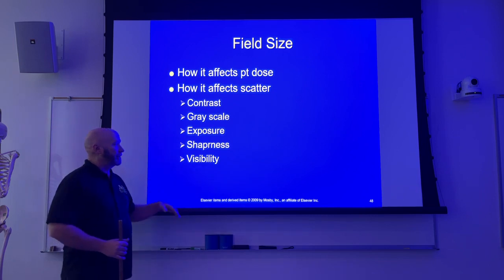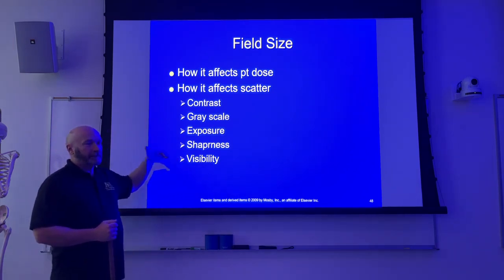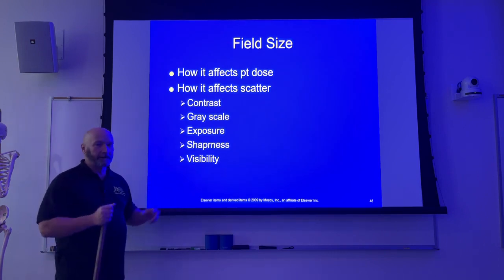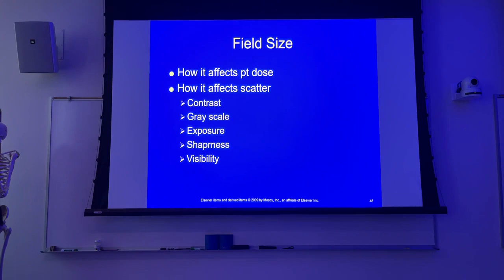Doesn't really affect your sharpness or recorded detail, but since it is a matter of scatter creation, then theoretically it could affect your visibility because it would give you a higher degree of scatter.